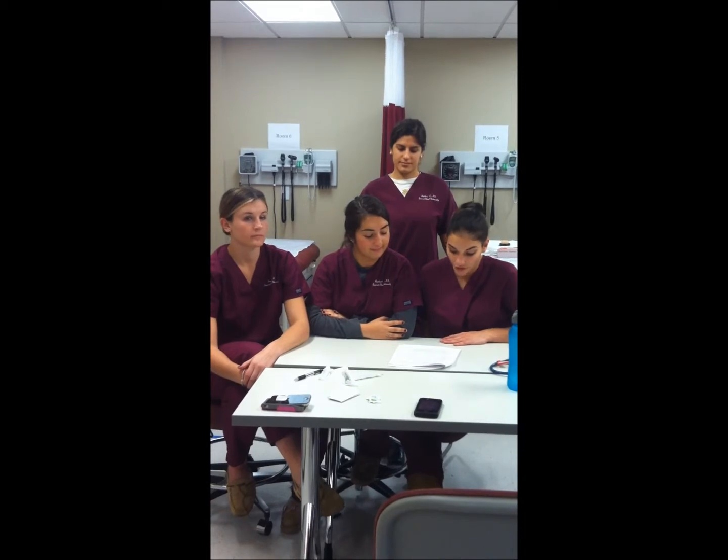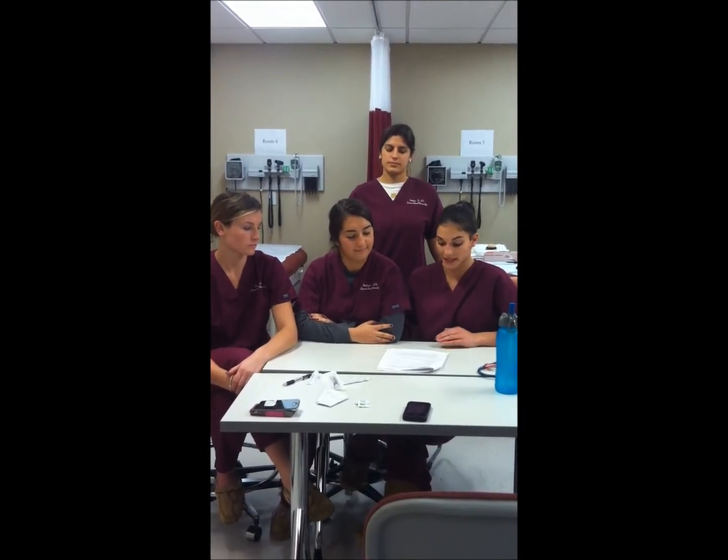Some complications when giving IM and subcutaneous injections: when withdrawing drugs from vials and glass ampules, a filter needle can help filter out particles such as glass, rubber, and other residues. When a filter needle is not used, there is a link between phlebitis, vascular occlusion, formation of granulomas, and septicemia.